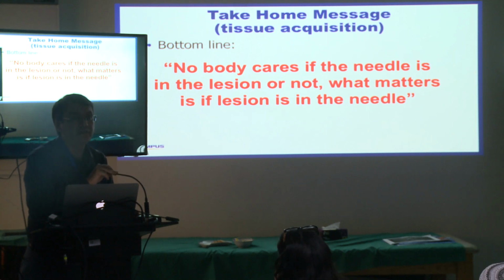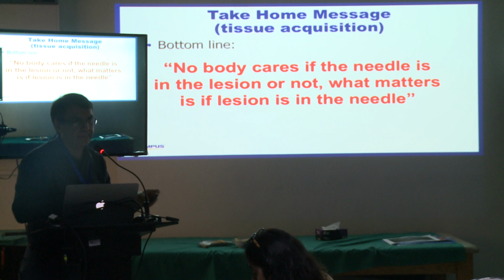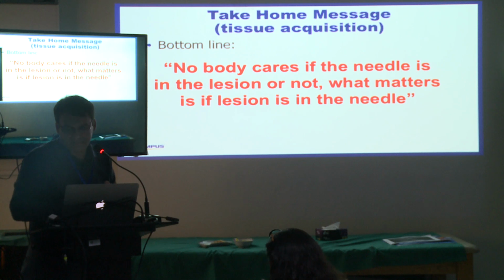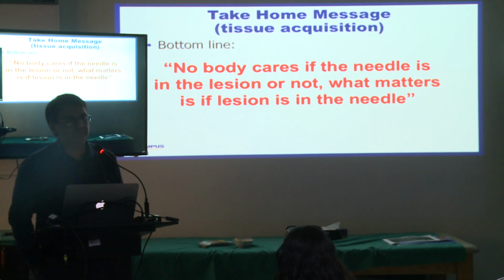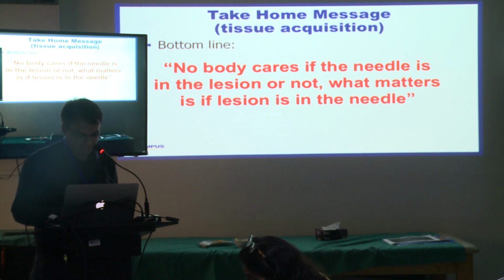A couple of things that I wanted to add. The therapeutic needles that we reuse are the 19 gauge needles that we use for cyst puncture. They go for gas sterilization and then they come back, and so far they've been okay. I'm pretty sure if you were to properly sterilize them with glutaraldehyde or whatever, you may be able to get away with it as well. But that is an issue.